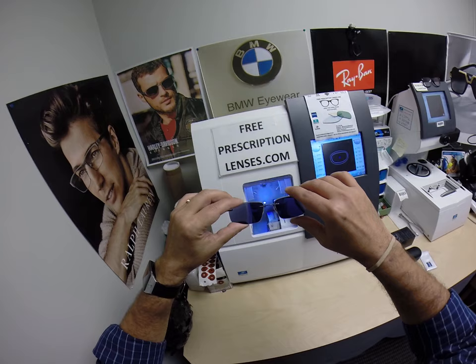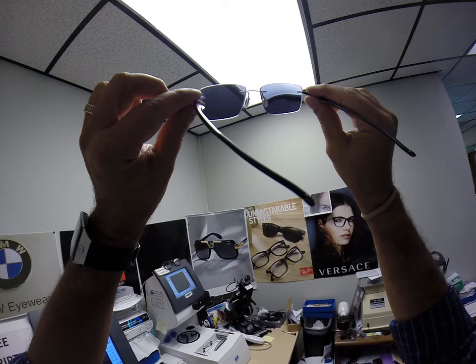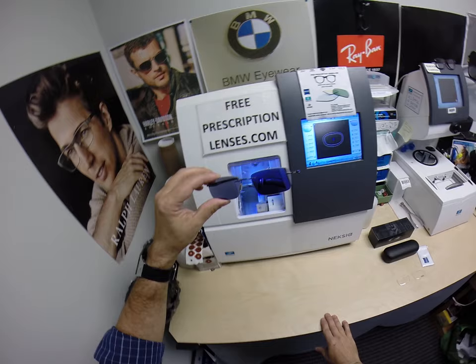They're also temperature sensitive, meaning they will get darker when it's 85 degrees and below than they will when it's 95 and above. But I'd like to remind everyone: when it's 100 degrees outside, you're miserable, they're miserable. Nobody works 100% when it's 100 degrees outside. So as I keep talking, these will get lighter and lighter.